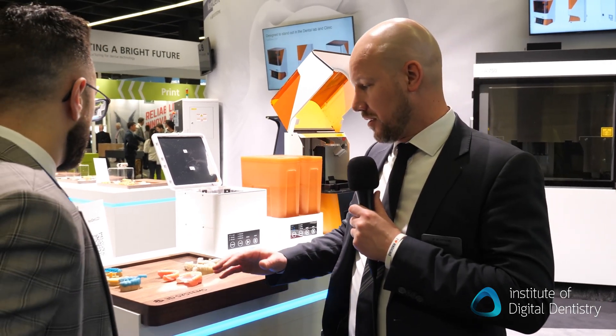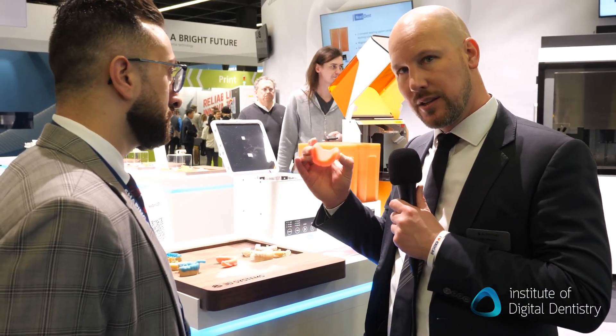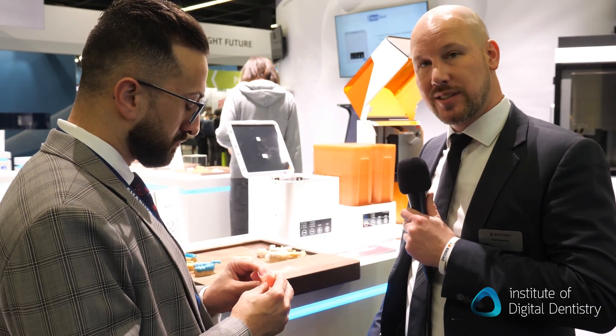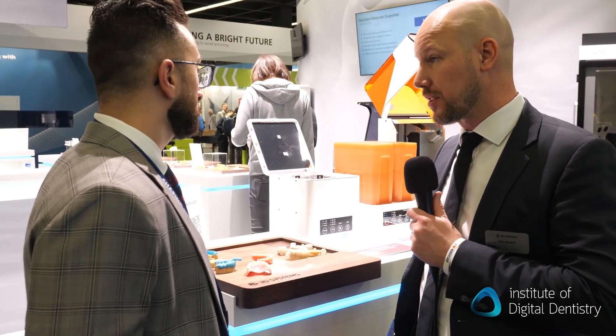On the material side, we have all the NextDent resins here. But what is new is our upcoming new base material, which is a higher impact material. It has a little bit of ductility to it, so you can also use it for partial dentures. And it comes in five different known denture shades. It is a next step in our denture 3D printing revolution.